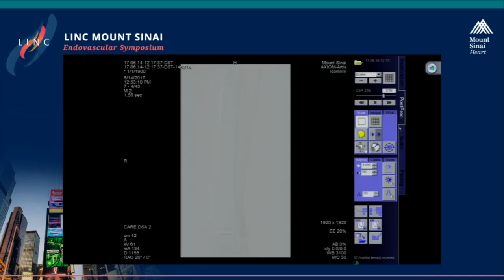And then we went to another view down below to show you better. And again, you can see here, I guess this is negative angiography. Let me go to the next one.